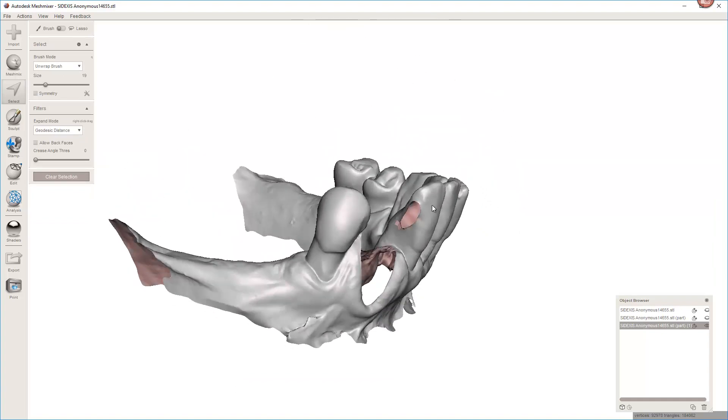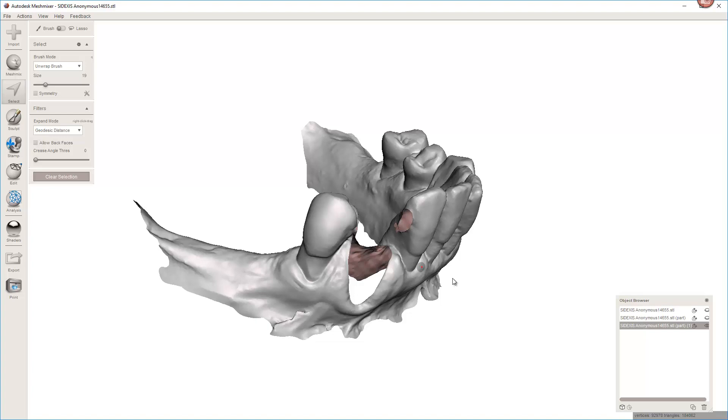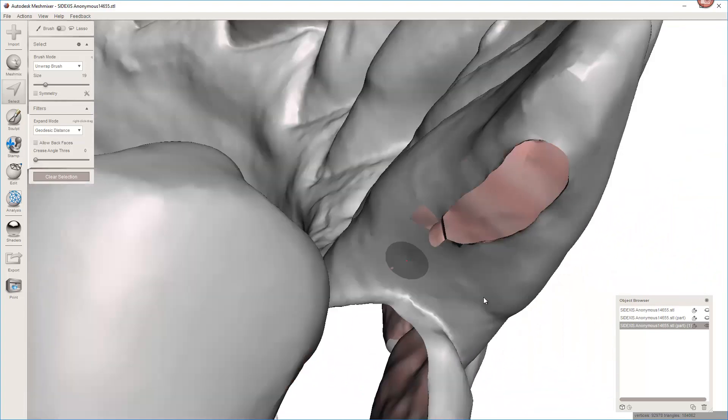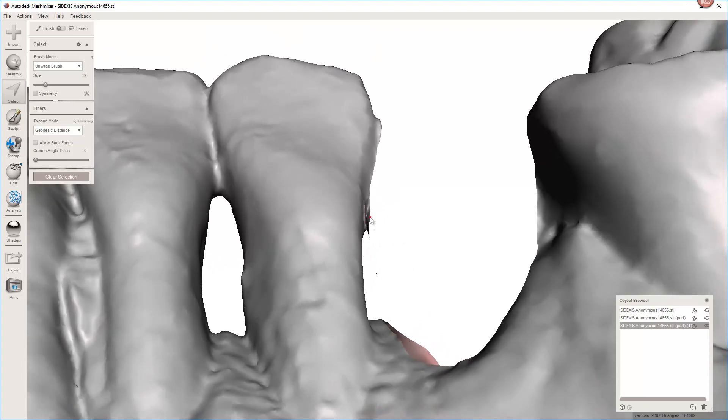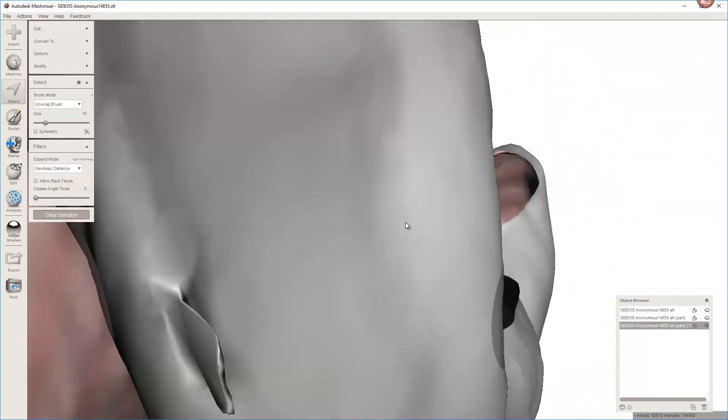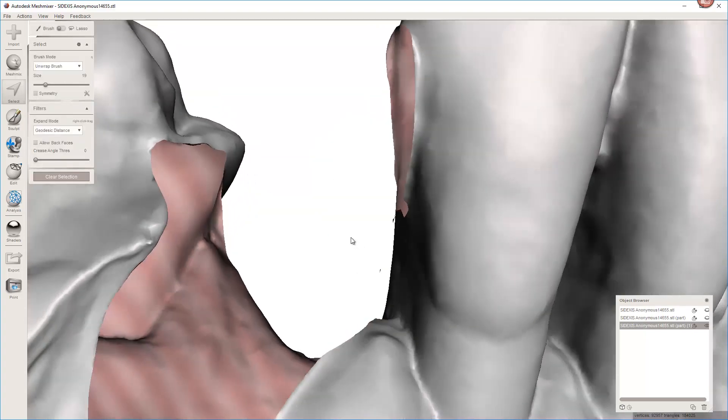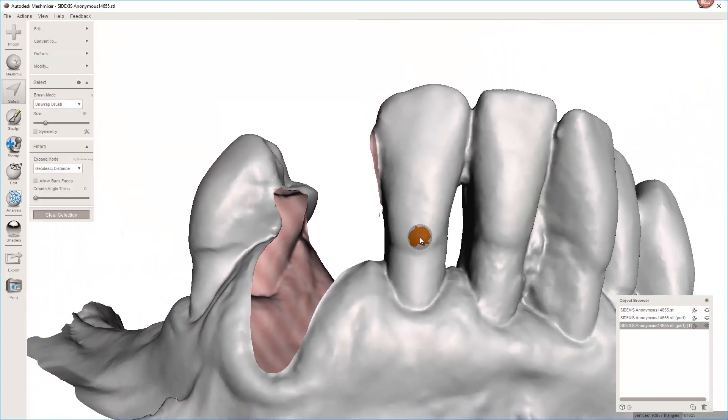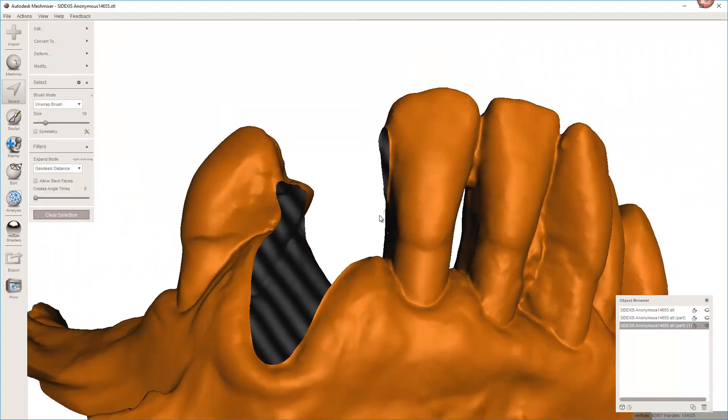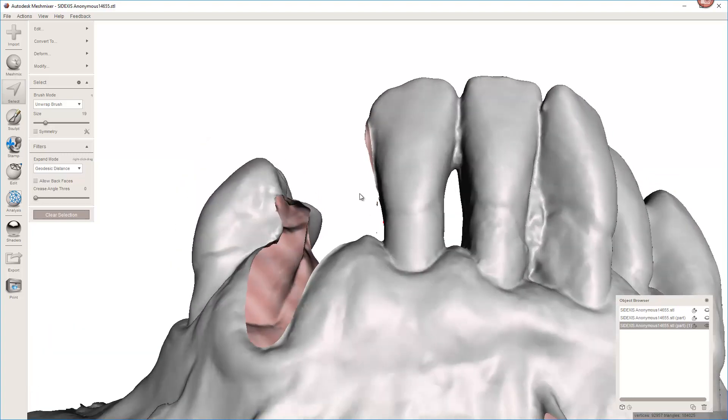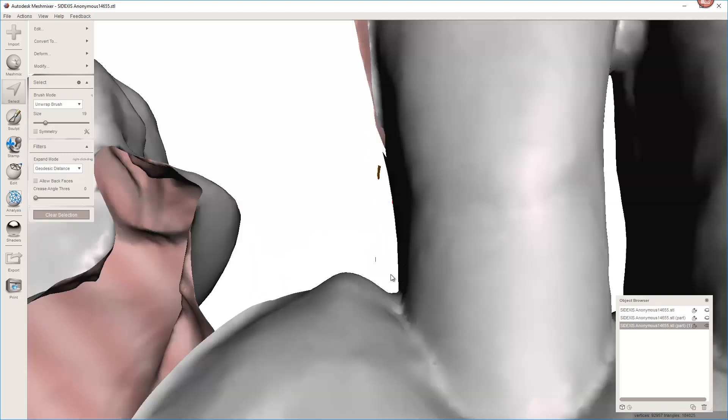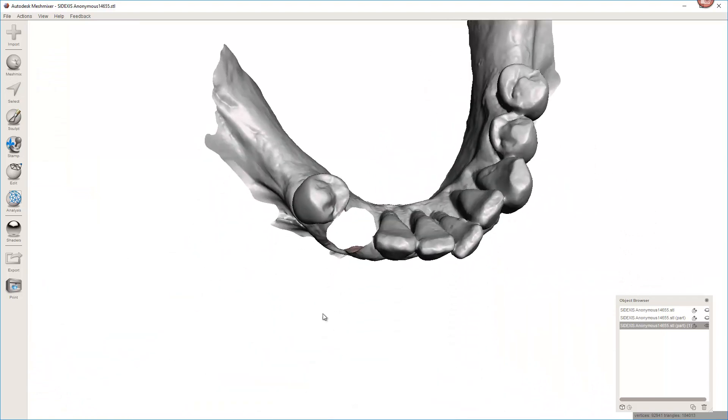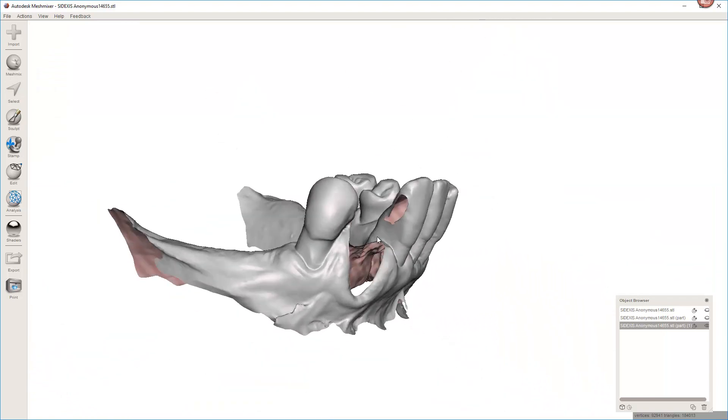So it all goes away. And now I'm just going to go and repair it. Now, I do see one little area. This isn't too common, but you can see how it's pink here. It's because it's sort of flipped outward. So I'm going to actually select that. I don't want to have that, it could cause me issues. I'm going to select everything. Hit I to invert the selection. Now, the only thing that's highlighted are these little pieces. And I hit delete. So now there's no little stragglers.